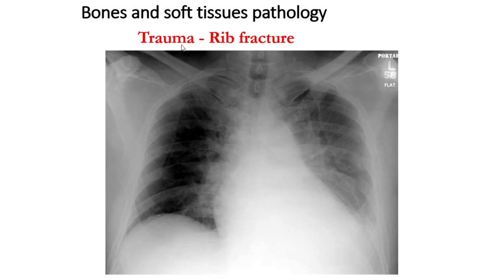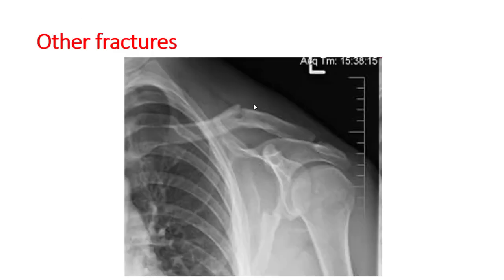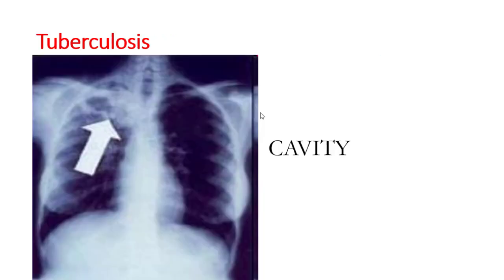Bony and soft tissue pathology: rib fractures may be found on chest X-ray — three or four rib fractures visible here. Clavicle fractures, such as left-side clavicle fracture, can also be identified on chest X-ray.